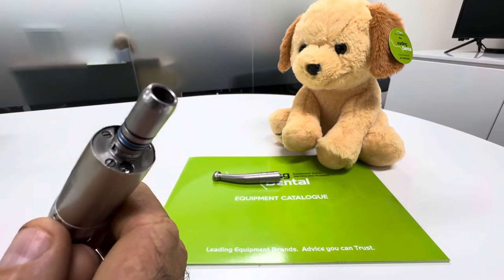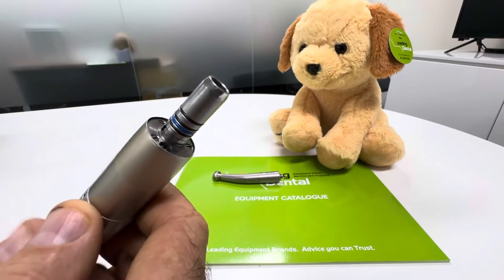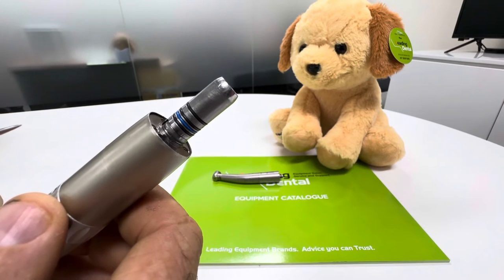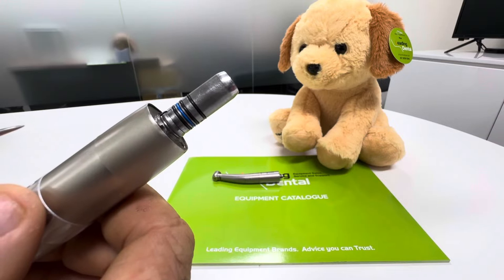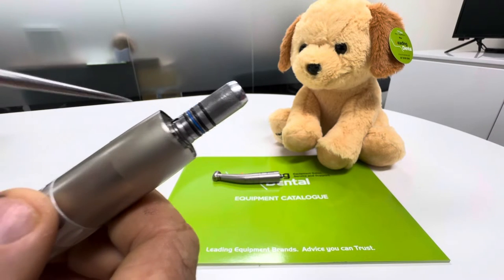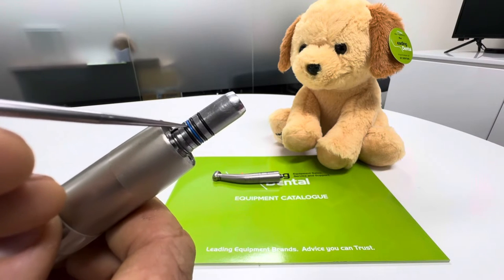First of all, the air motor. This is an older style titanium air motor, but whether it's electric or air they're all very similar when it's the e-type fitting. Now this one's also got internal water, so it's got one of these little blue o-rings here, which is unique to the NSK motors with the water.